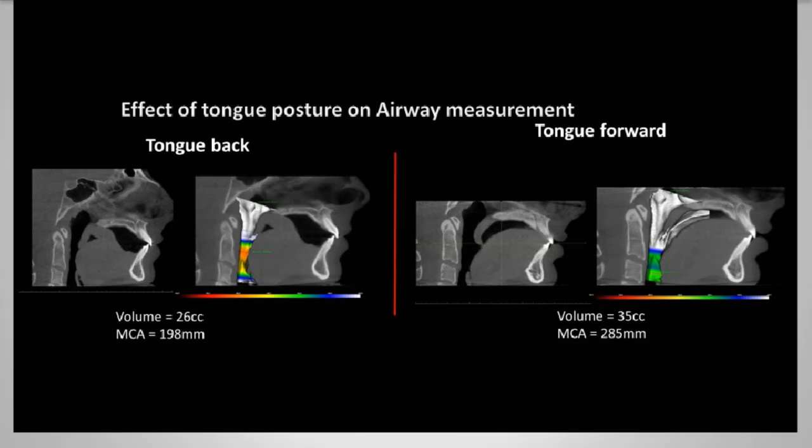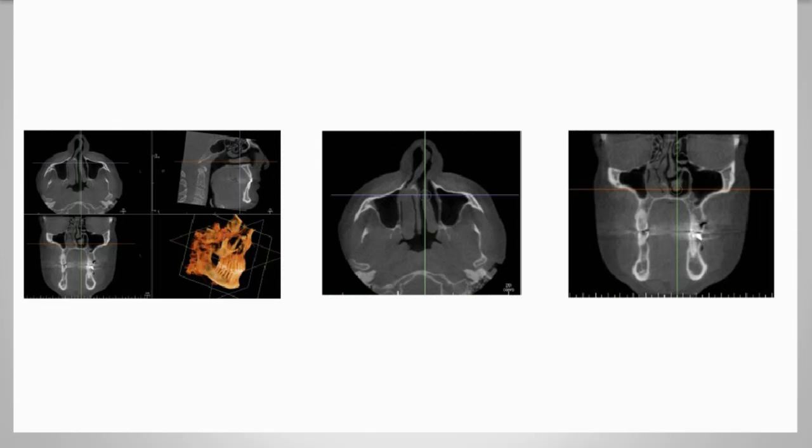Here is an example of my particular scan, my own personal scan. And you can see here, for those that maybe aren't too used to looking at these images, this is a view from the bottom looking up, an axial view of my deviated septum. And I've suffered from allergies and mouth breathing all my life. And it wasn't until I scanned myself a couple of years ago that I detected this significant problem. Look at my turbinates. Here's a cross-sectional view, a coronal view. You can see my enlarged turbinates. Sinuses look pretty clear, but I had, of course, severe nasal deviation with enlarged turbinates.